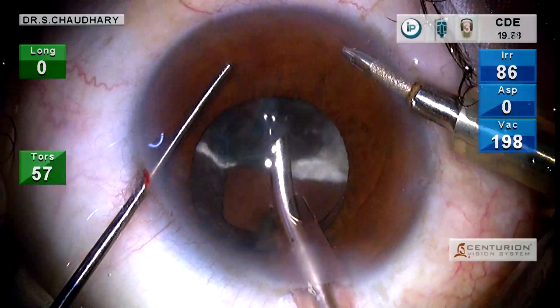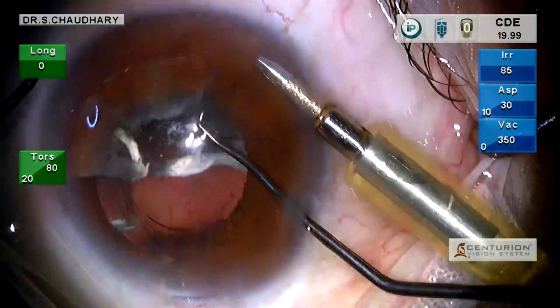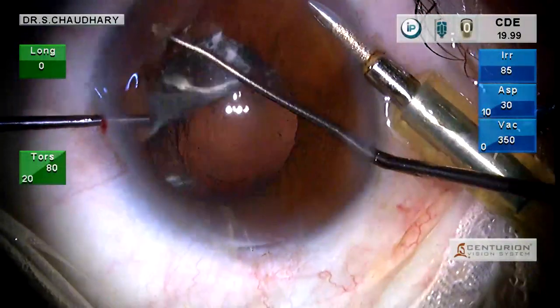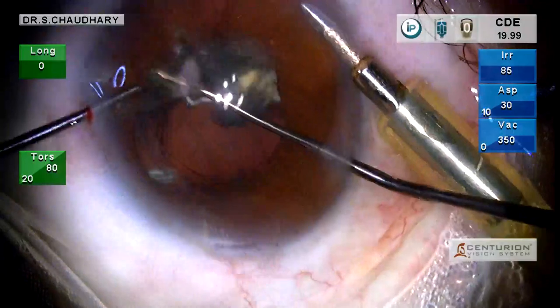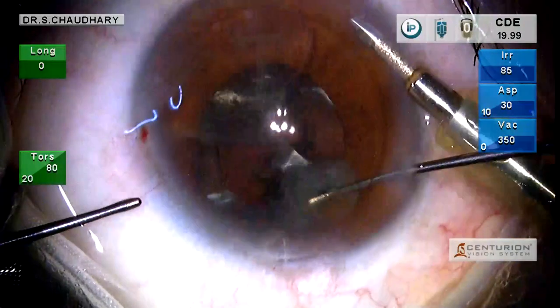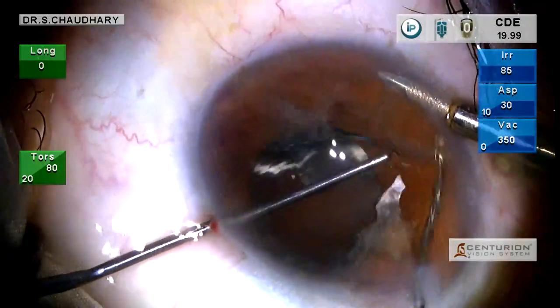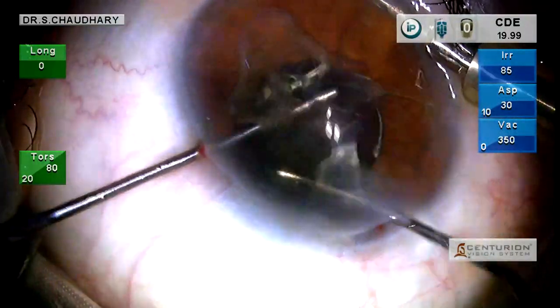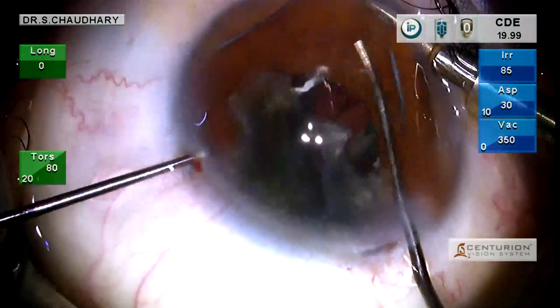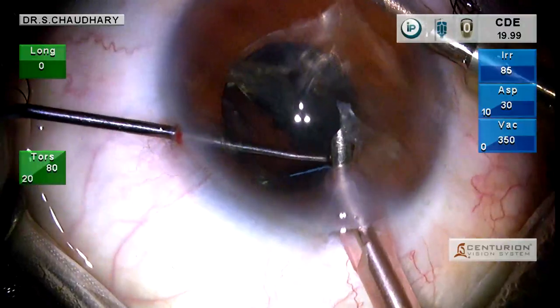We can see large chunks of epinucleus lying there. The flexibility of the bandage contact lens allows us to bring these pieces up out of the capsular bag, through the pupil, and under the contact lens, then guided over the contact lens. Now they are in the concavity of the BCL and can also be emulsified without risk of debris falling into the vitreous.